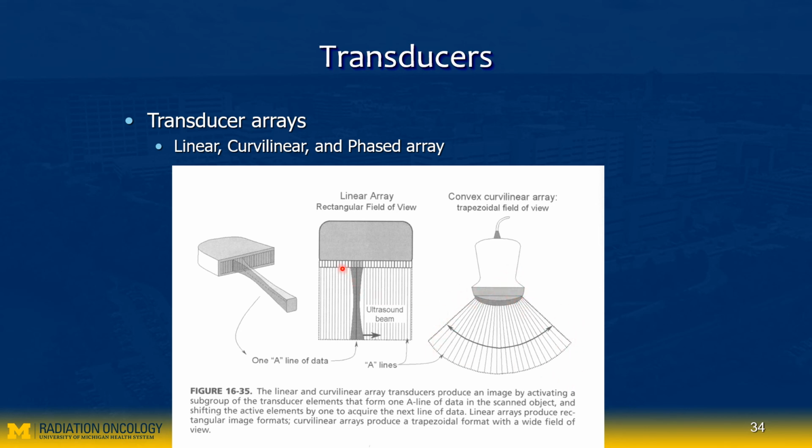The ultrasound will sweep across like this shape. As it goes, it sends the signal out, then detects the echo, sends the signal out, and detects the echo.